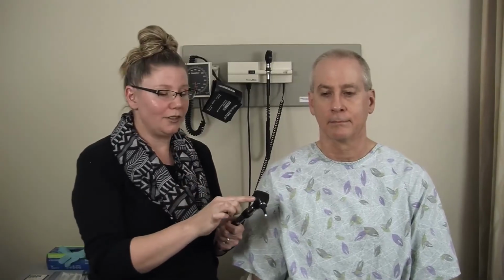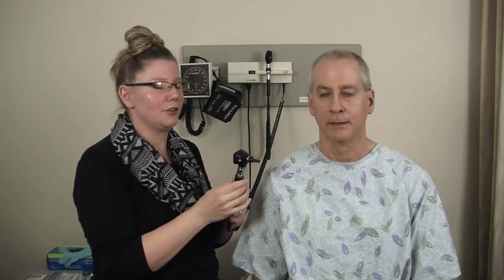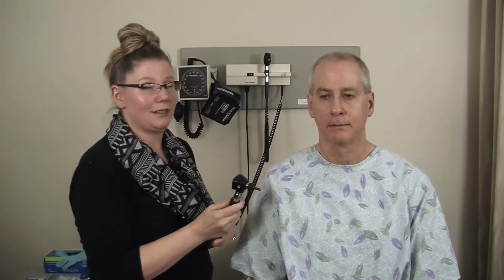And then also for mobility, which we won't be testing today, but a lot of times to test mobility of the eardrum, you have an insufflator, which is like a rubber bulb that hooks on with a small tube. While you're doing the exam, you gently squeeze it to push air back and forth to see if the eardrum moves. We will not be doing that today.